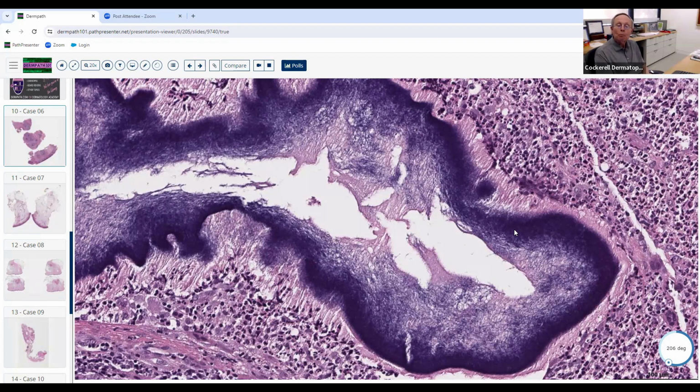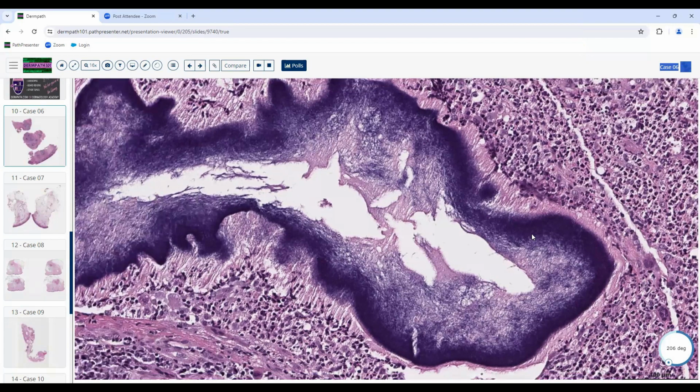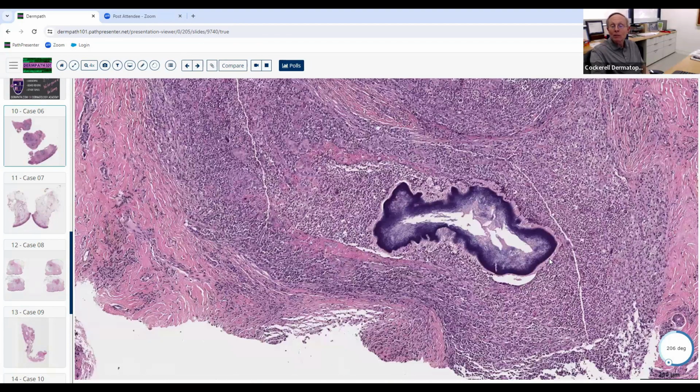Which bacterium? Well, I was thinking of botryomycosis, and I know staph is the most common cause of that. Okay, now they could throw that on there. Why is that not so good here in this grain that we're looking at? Why is botryomycosis not the best answer? This is a really sophisticated question that I doubt they would use. It might get thrown out because everybody might miss it, but why is this not great for botryomycosis? There are two reasons, but there's one main reason.